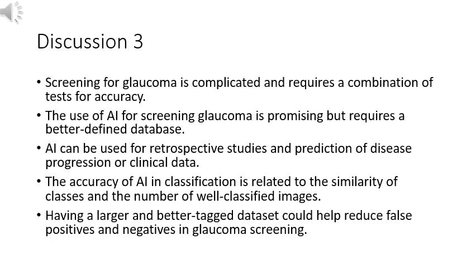Other publications on automated detection of referable AMD with accuracies of 90% can be found in the literature. 18,26 With our CNNs, we have achieved 86% accuracy, because we have included all types of AMD, including the early stages. At this point, one of the most important reasons for misclassification is difficulty in differentiating between early stages of AMD and normal retinas. We believe that it is worthwhile for future research to study the classification of AMD stages using AI in CFP, as other authors demonstrate using OCT 33.